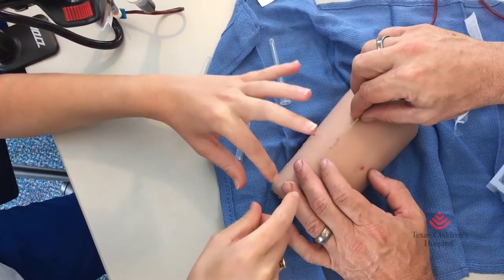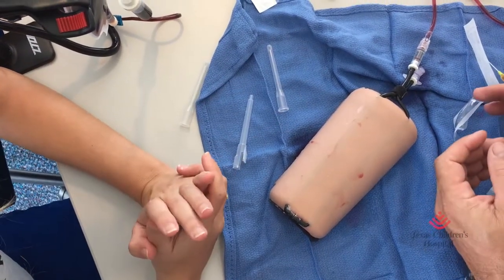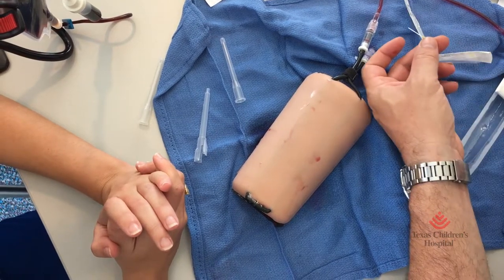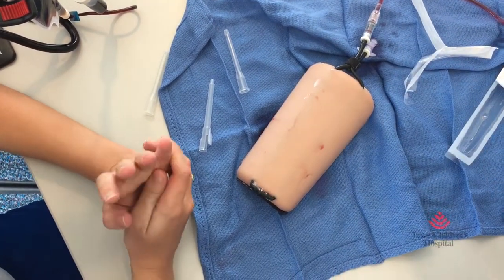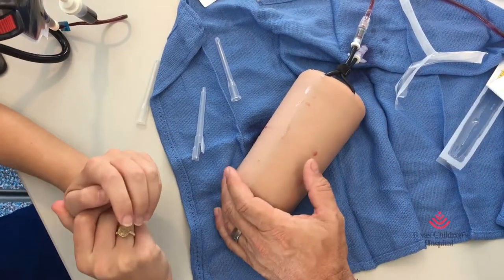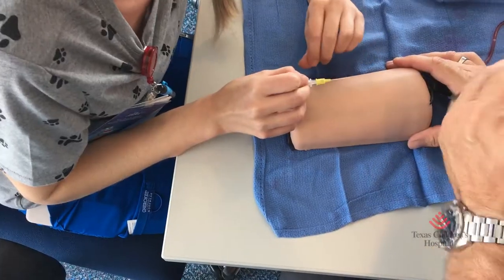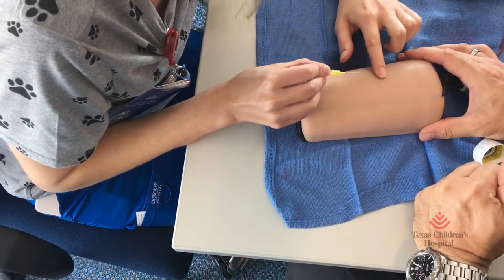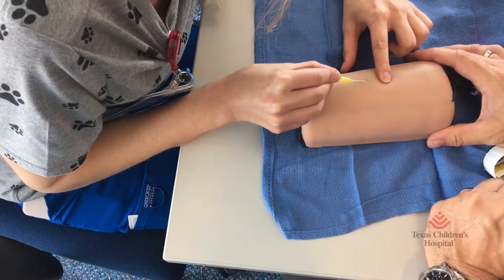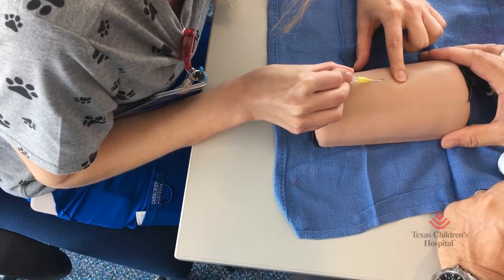That's what I struggle with — holding it. A lot of people move the stick and then move this back as they're advancing. You need this metal in there to guide the plastic sheet. So it's kind of a — you use a little steeper angle to hit it. That's a perfect angle right there when it comes out of the catheter. This little sheath comes out of here and it's better off the tip.